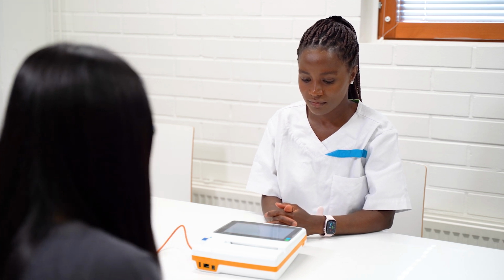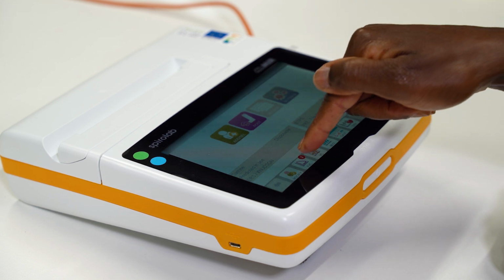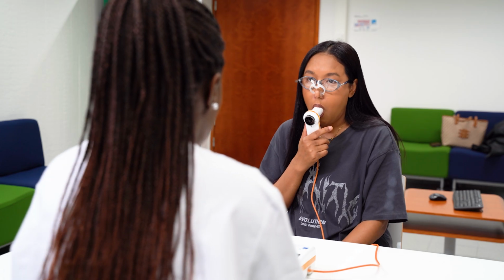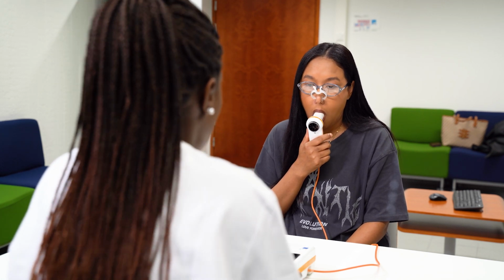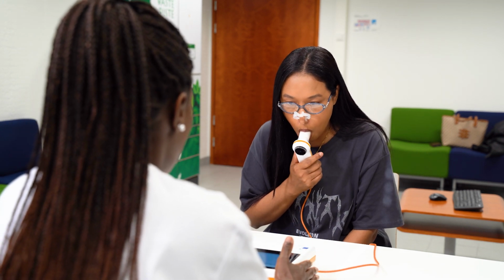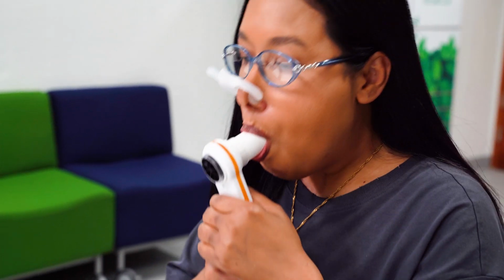Select the FVC icon and you will see the test screen where you will see the graph turning in real time. Now the patient breathes normally, then takes a deep breath, filling their lungs completely, and exhales all the air in the lungs as fast as they can and as long as they can. During this period, the nurse motivates the patient to achieve accurate results.